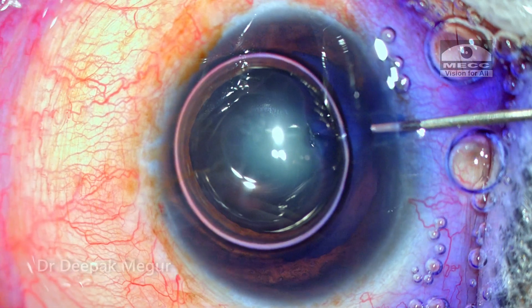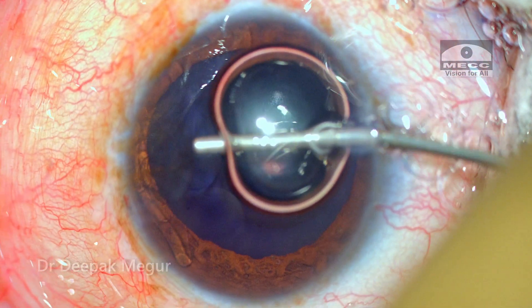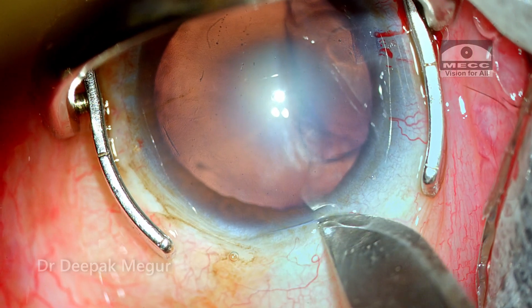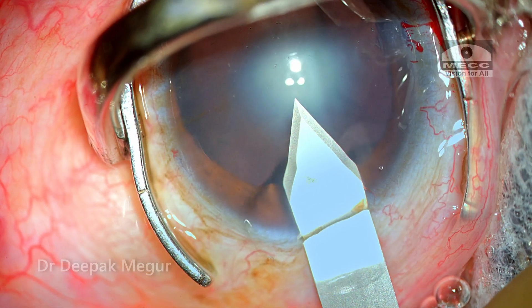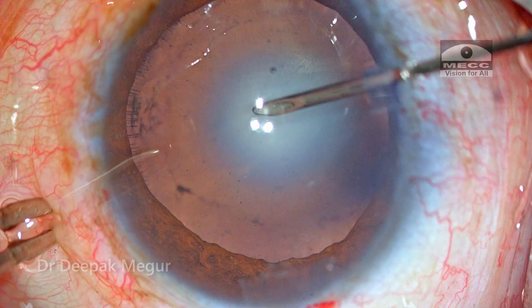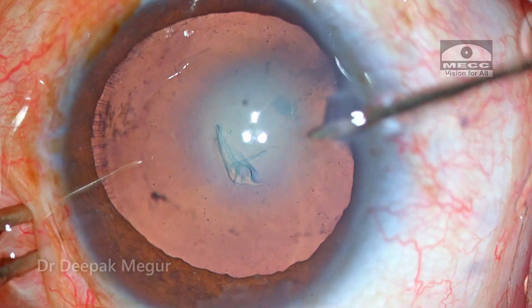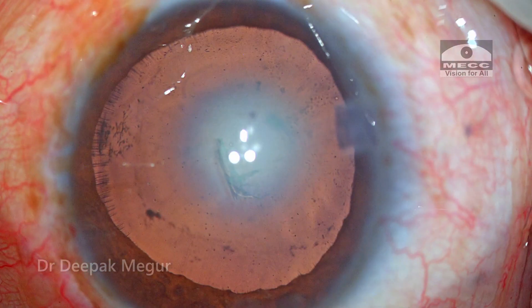Let me take you through the thought process one should have while planning such cases. Although it does not look intimidating, we need to have our plans ready. The first step where we really get an idea of zonular health is when we puncture the anterior capsule — that's the only time when we really come to know the exact health of the zonules. As I'm puncturing the capsule now, I can see that there are not many radial folds emanating from the puncture area, indicating that the zonules are quite healthy.